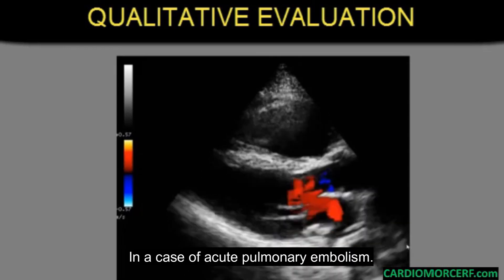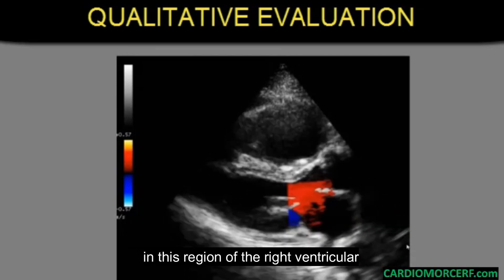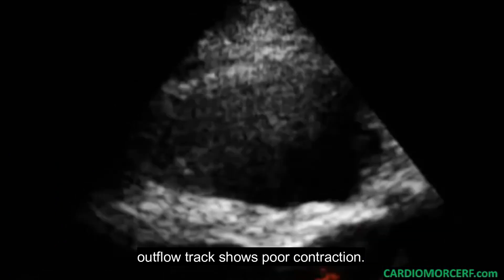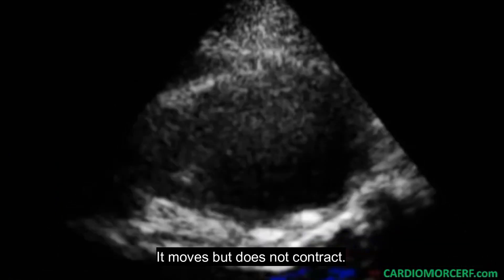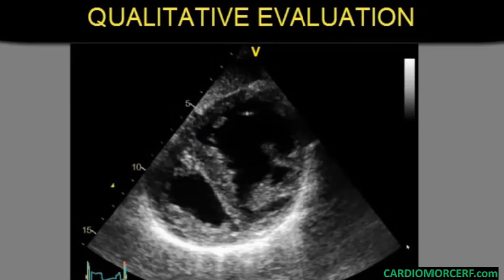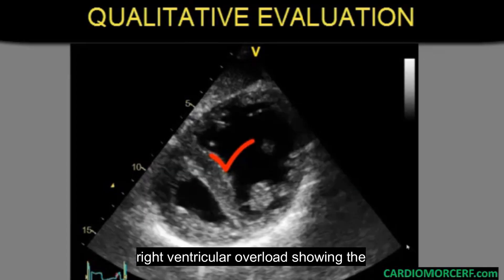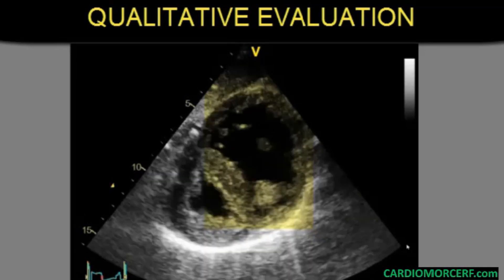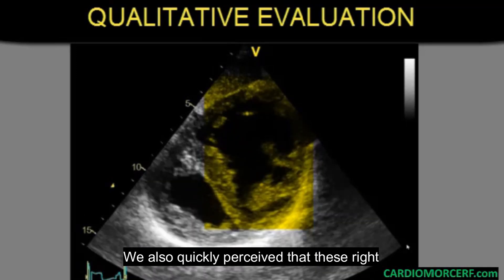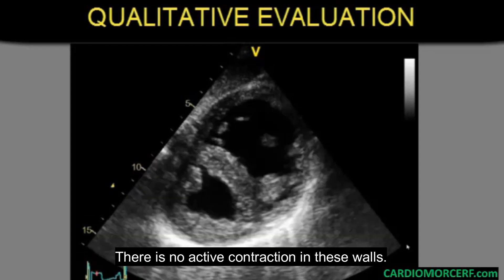In a case of acute pulmonary embolism, we saw that the right ventricular wall in this region of the right ventricular outflow tract shows poor contraction — it moves, but does not contract. In this patient with a critical systolic right ventricular overload, showing the characteristic flattening of the interventricular septum, we also quickly perceived that these right ventricular walls are not thickening normally.